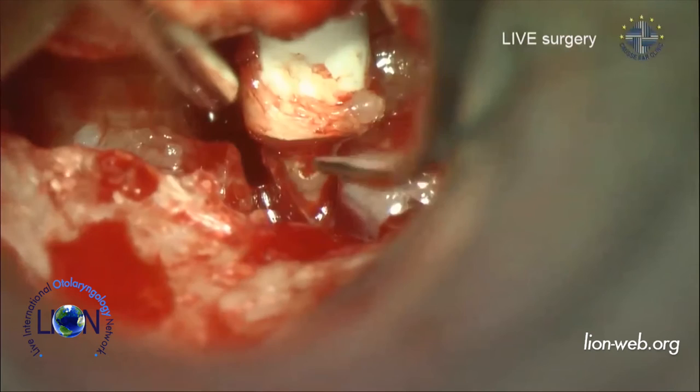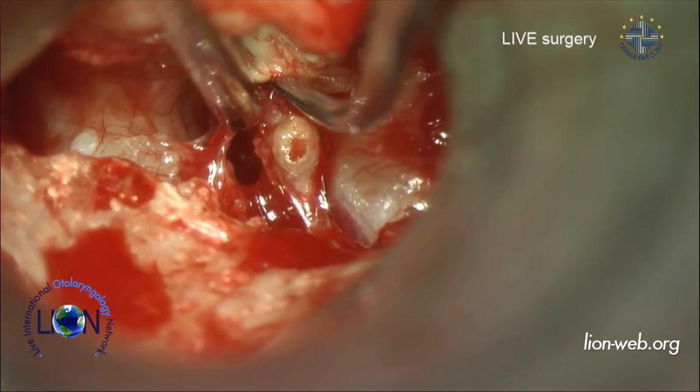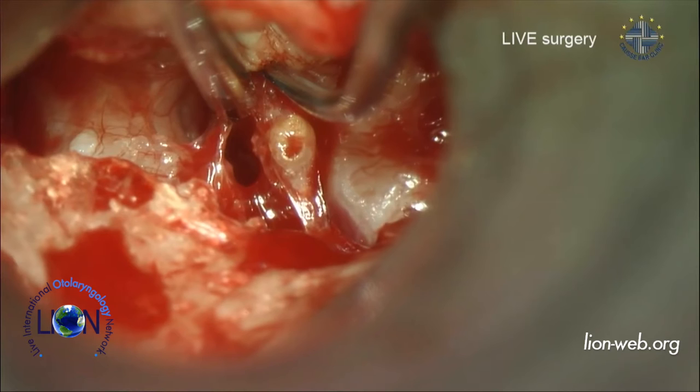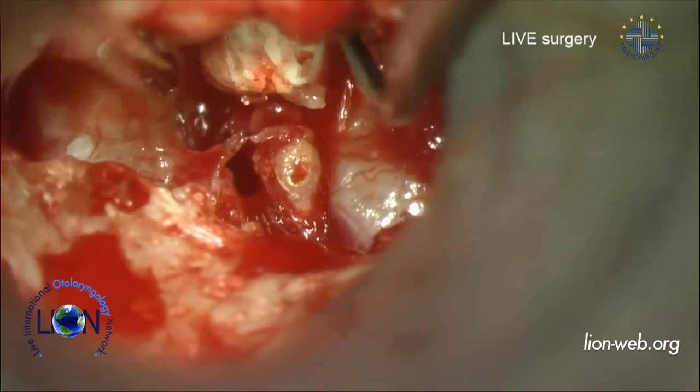Robert, have you ever seen in these cases that once you've removed the PORP, you find there's possibly a fracture of the posterior... Of course, erosion. Yeah, I've seen that. So you see, I'm doing it very progressively like this. I can control the effect on the stapes while I'm doing this and trying to stabilize the stapes with a sucker while I'm pushing the prosthesis anteriorly, progressively. And now it's fine. Now I can remove the prosthesis.